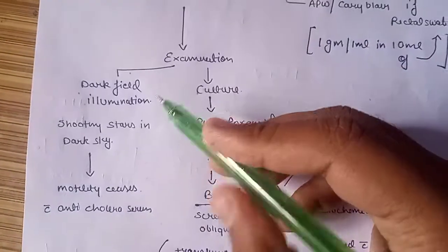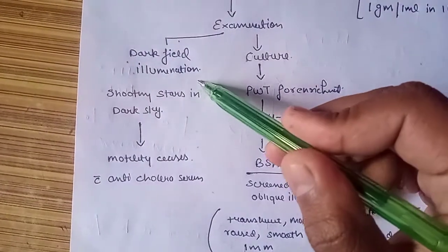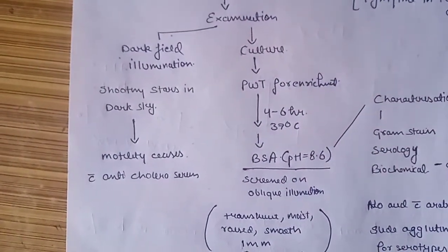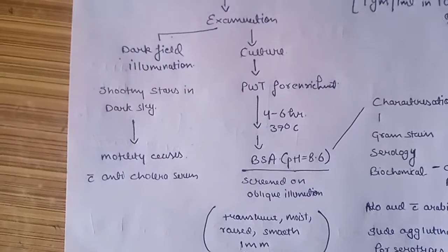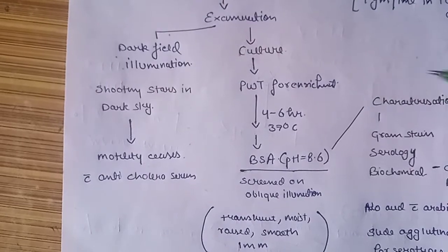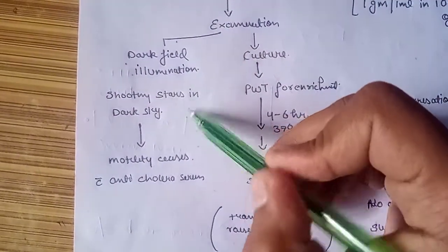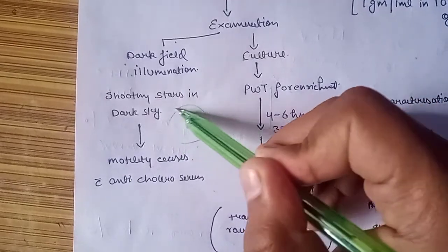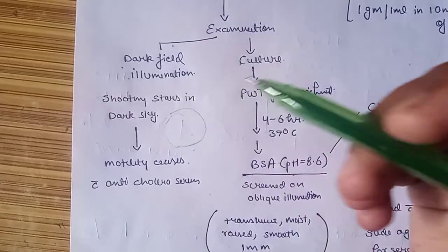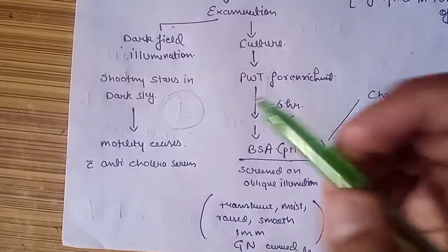Okay, so we can directly go for dark field illumination, and doing this directly gives a good result. In around 80% of cases, we can directly diagnose the disease within hours. But in cases where this is not diagnosed, we need to do the enrichment through culture. So when we do dark field illumination, we see a characteristic sign of shooting stars in dark sky. Okay, as you would have studied, as you would have seen the images of this.